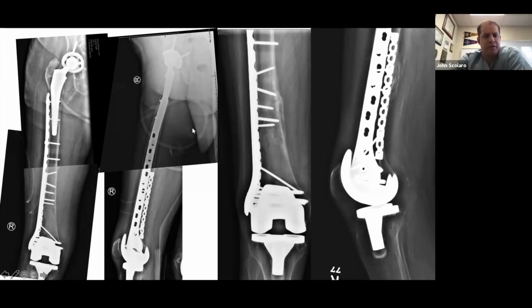I don't think anything. I like this. Going back to the initial question that you posed, in poor bone quality like this, the lag screws function to help you achieve reduction in order to place the next dominant implant.